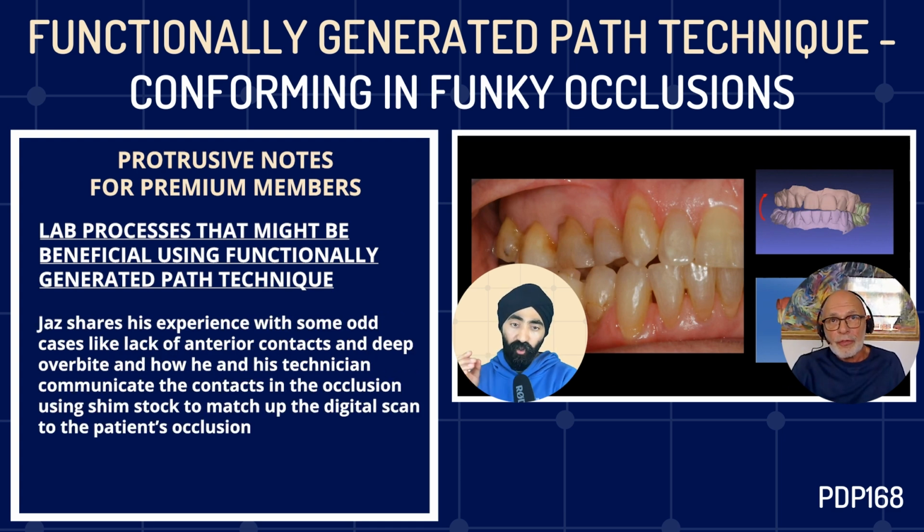I'll just add to that, Tom. In my experience, I work with a great technician. His name is Graham, and in the odd case, especially when there is a lack of those anterior contacts, you have difficulty, or sometimes you have a really, really deep overbite, so deep that actually the anteriors slip past each other. Even that can rock in a different way, and that can be tricky as well.